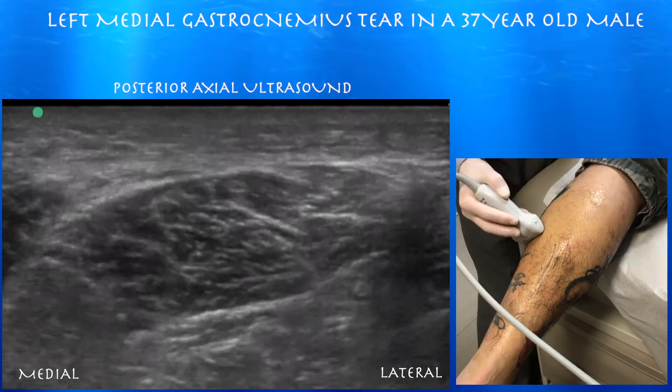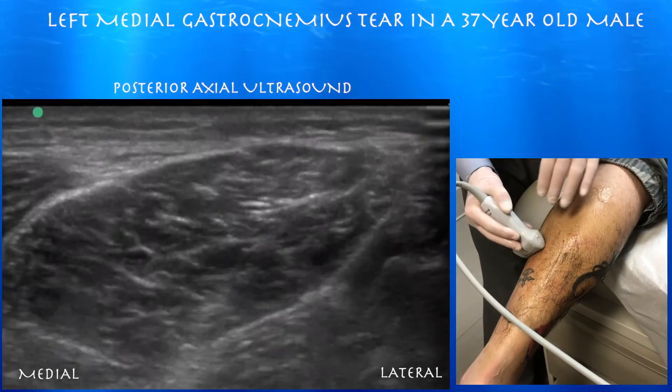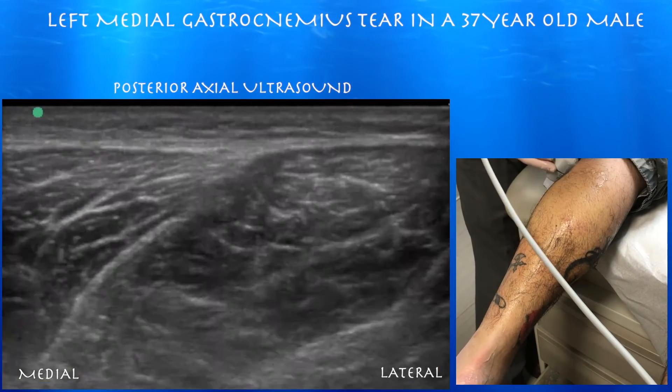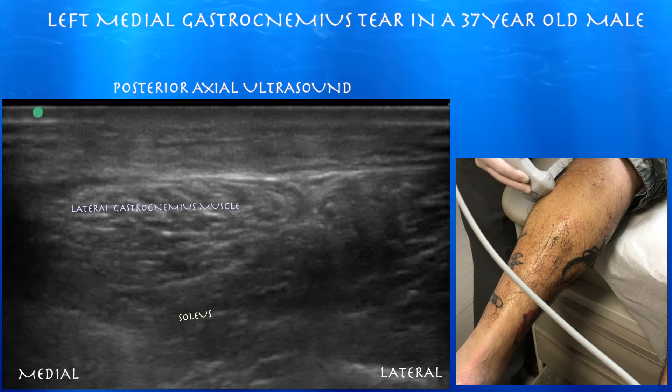Right side of the screen is lateral. We're doing the lateral gastrocnemius at 1352, just looking at the muscle, which looks okay. Normal-appearing lateral gastrocnemius muscle. You can see the underlying soleus muscle below it.